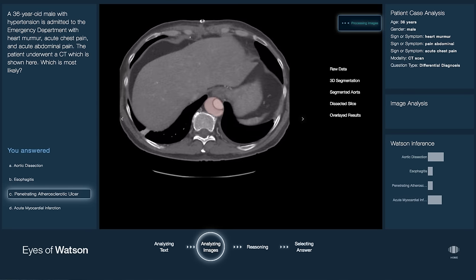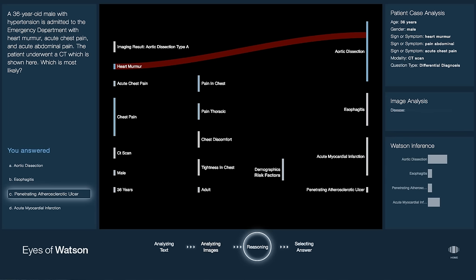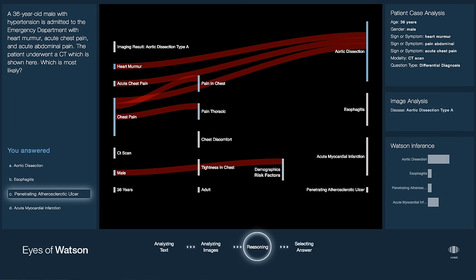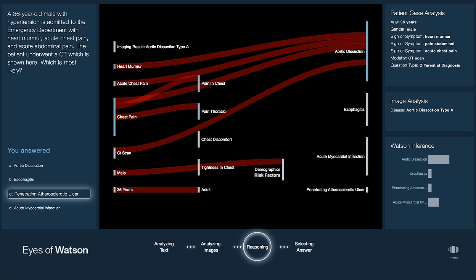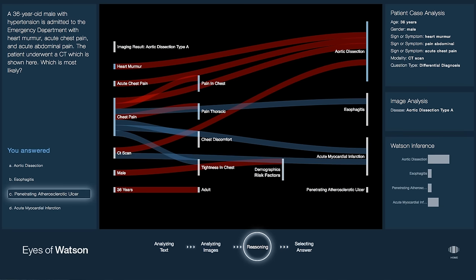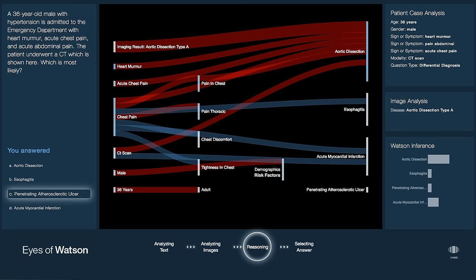Watson then takes the clinical concepts derived from the imaging exam and case descriptions, and begins its reasoning process using clinical knowledge. Paths are explored and scored in the knowledge graph while searching for related concepts and facts that lead to the specified conclusions, starting from the chosen clinical concepts.